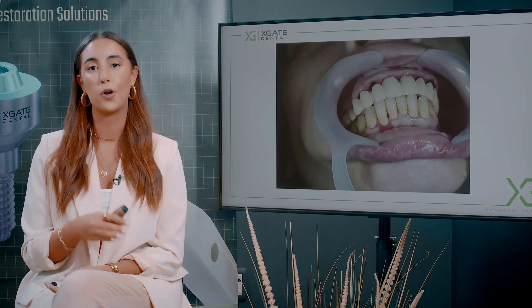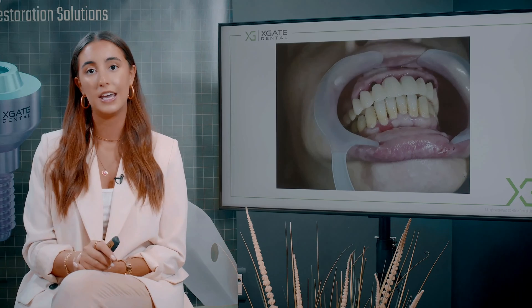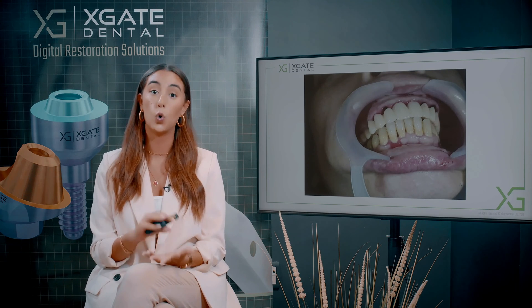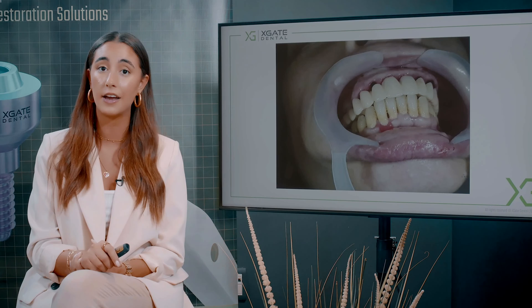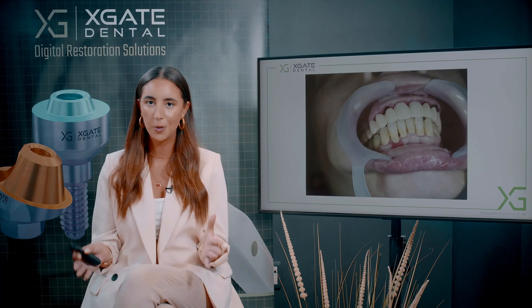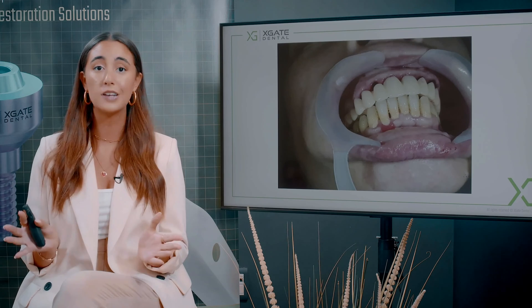Here you can see the temporary bridge. There is some space between the gingiva and the bridge because you want it to heal properly and allow the patient to clean it. After the extractions, the implants were placed, and you need to wait three to four months for osseointegration and the healing process to complete. The temporary bridge was made right on top of the existing implants with the multi-units she already had. The front teeth were made exactly as they were before — they were offset. You're probably wondering if the two front teeth will hold the bridge — well, for two to three months while waiting for osseointegration, yes, they will hold.